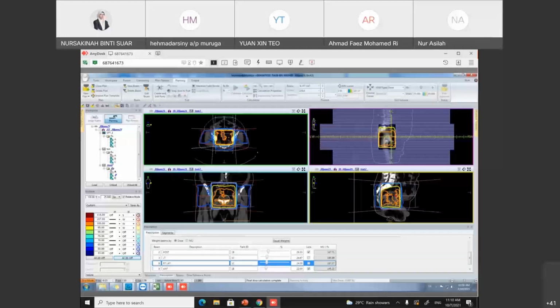So if the doctor says, I don't want this 60%, how can you make it nicer? Can anyone answer me this one? It's related to PDD and the previous example I showed you just now.